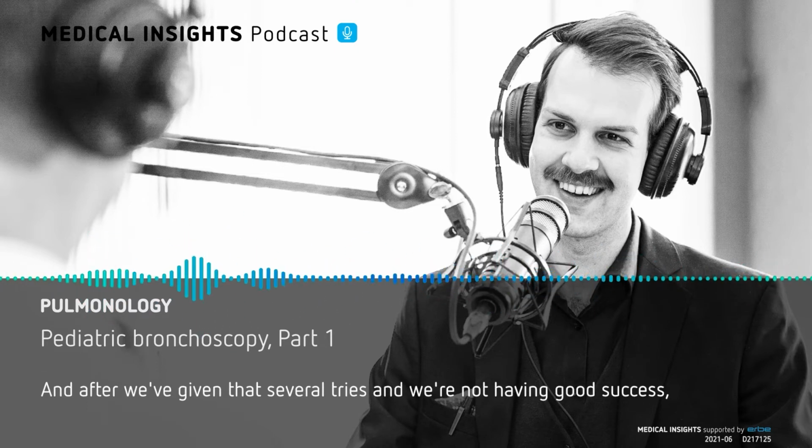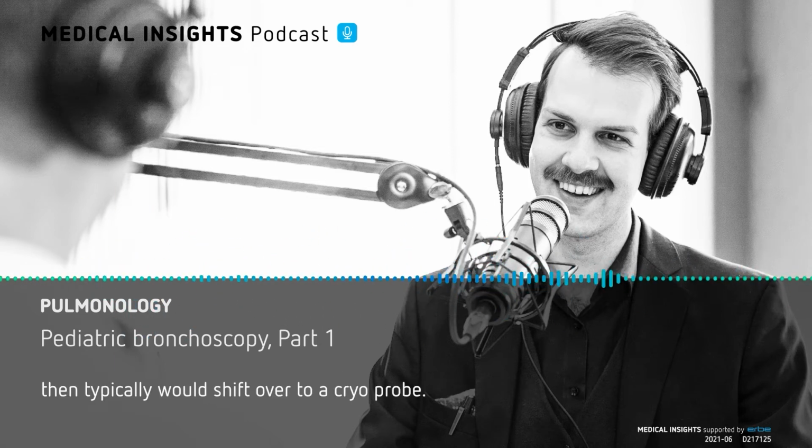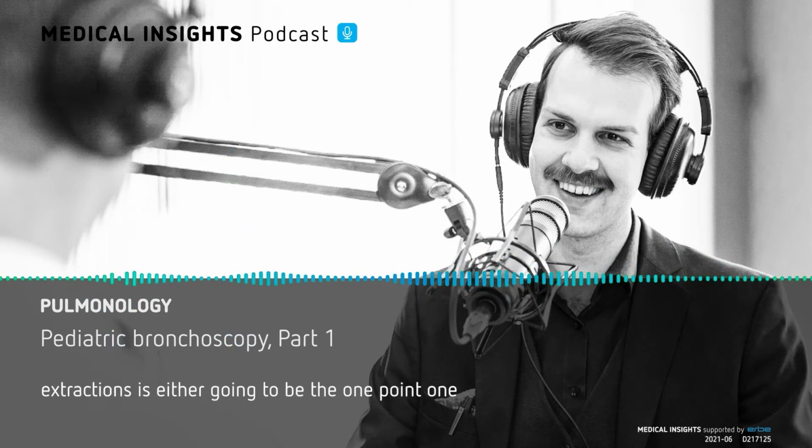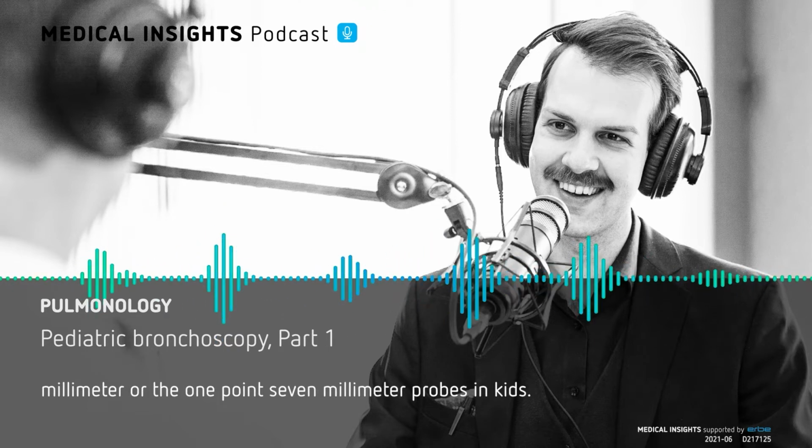And after we've given that several tries and we're not having good success, then we would typically shift over to a cryoprobe. So with the cryoprobe, the most common ones that we're using for clot extractions are either going to be the 1.1 millimeter or the 1.7 millimeter probes in kids.